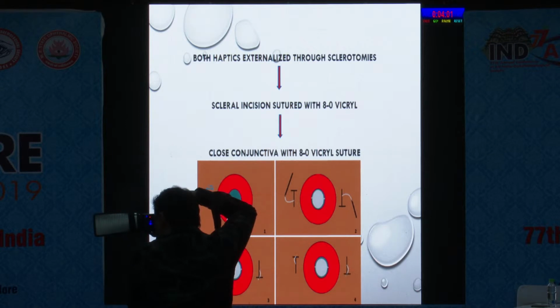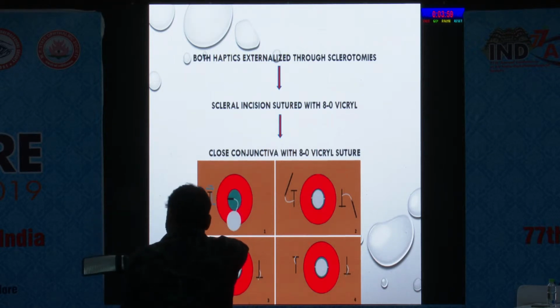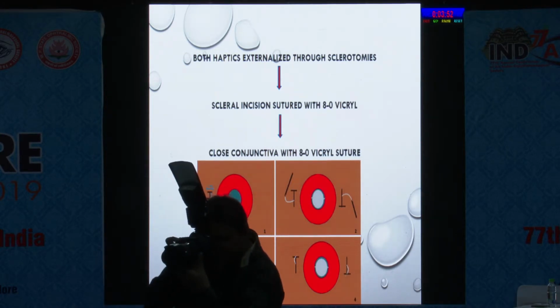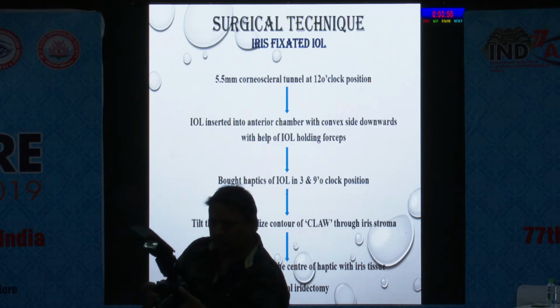Both haptics were externalized through the sclerotomies, and the haptics were buried into the tunnel. The scleral incision was closed with 8-0 Vicryl, and the conjunctiva was also closed with 8-0 Vicryl.